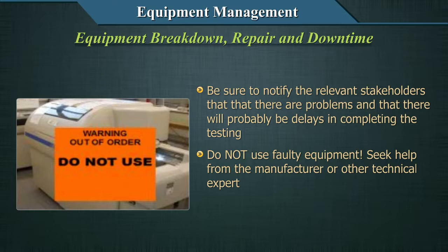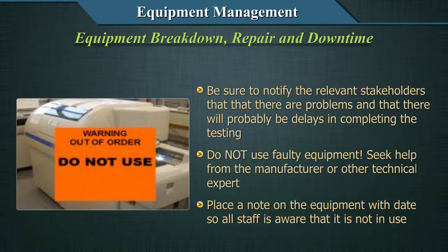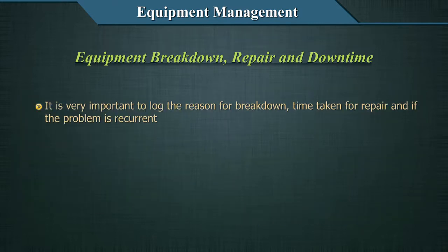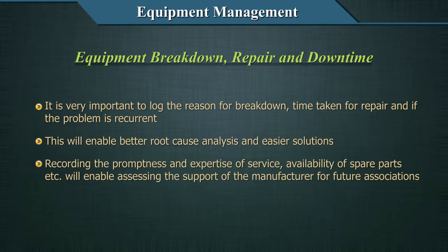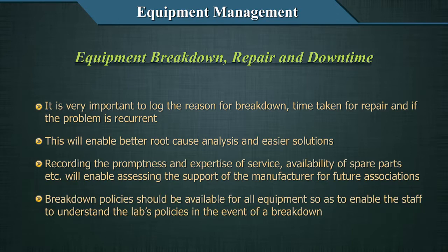Seek help from the manufacturer or other technical expert. Place a note on the equipment with the date so all staff are aware that it is not in use. It is very important to log the reason for the breakdown, the time taken for the repair, and if the problem is recurrent. This will enable better root cause analysis and easier solutions. Recording the promptness and expertise of service and availability of spare parts will enable assessing the support of the manufacturer for future associations. Breakdown policies should be available for all equipment so staff understand the lab's policies in the event of a breakdown.